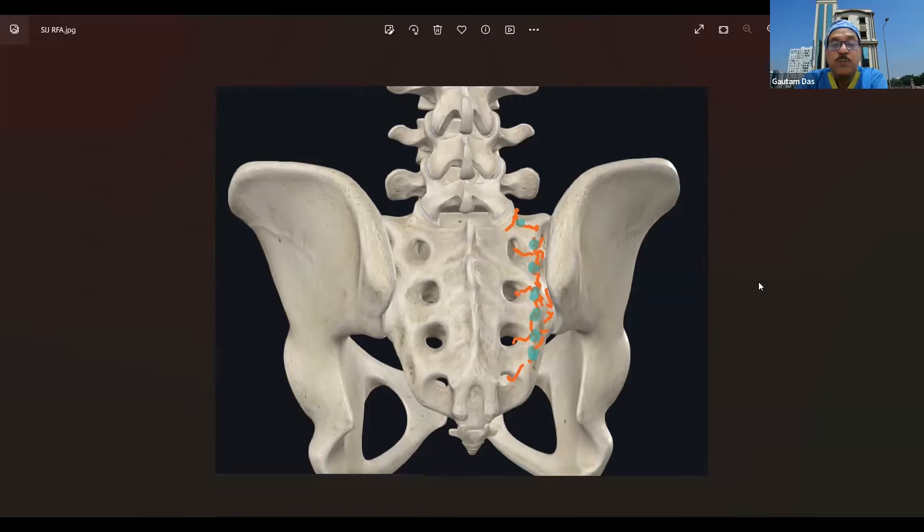So when you are planning to denervate the sacroiliac joint, we cannot access the ventral rami branches. For the dorsal rami branches, what you can do is at the S1, S2, and S3 foramina, we start placing the needle from the upper part of the S1 foramen on the lateral side — in the space between the sacral foramen and the iliac crest.